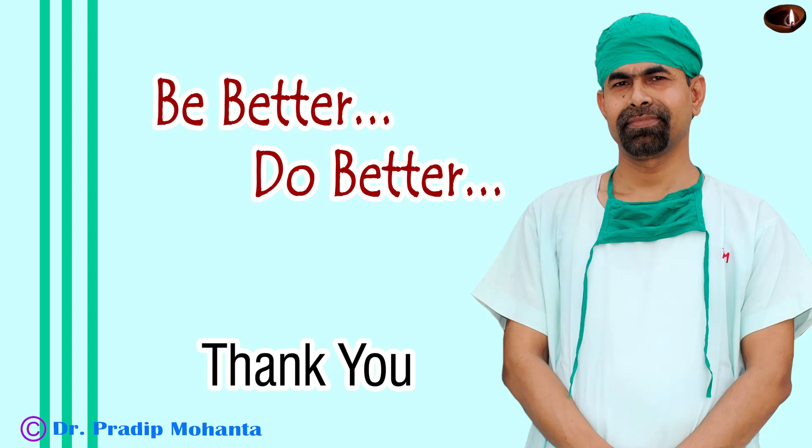I hope this video will inspire you to try this pre-chopper, particularly in soft cataracts where you cannot hold the nuclear mass with high vacuum.